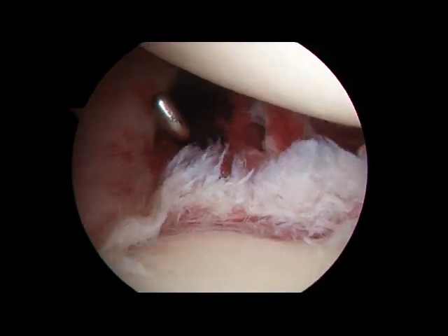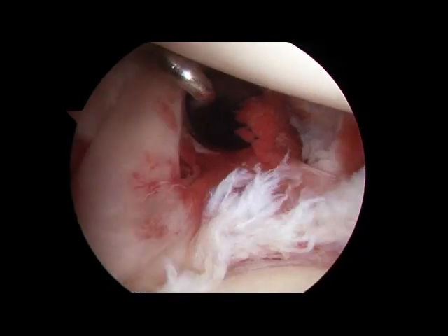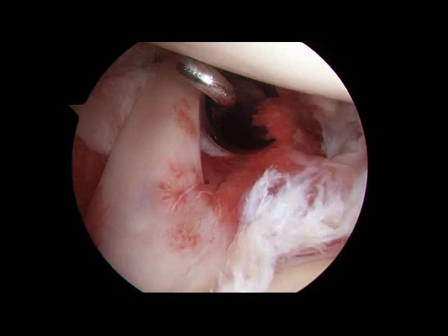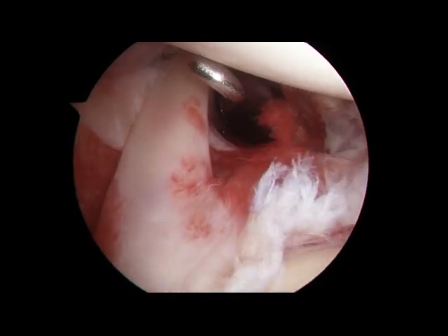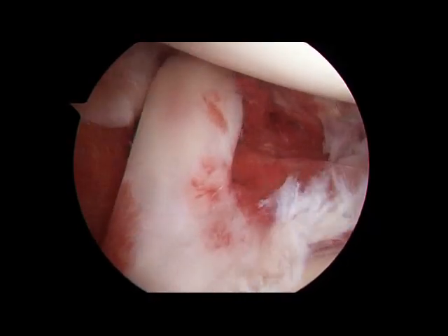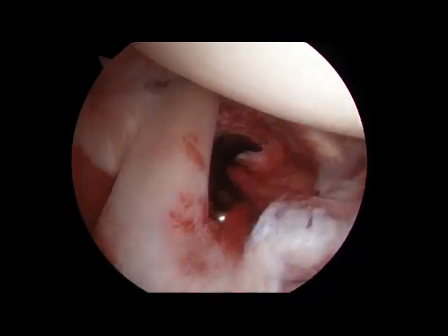Dr. Bach, we're just going to start with your shoulder surgery. When you were asleep, you had a lot of stiffness, like frozen shoulder — less than 50% of what you had on the other side. But once we did the manipulation and gently moved the shoulder around, it really broke up the adhesions and we got full range of motion.